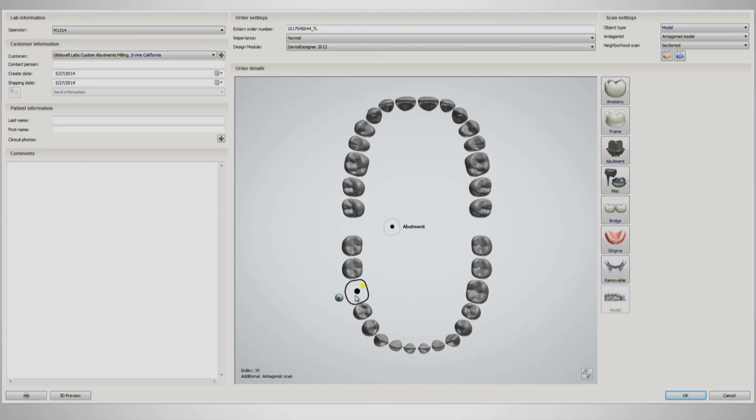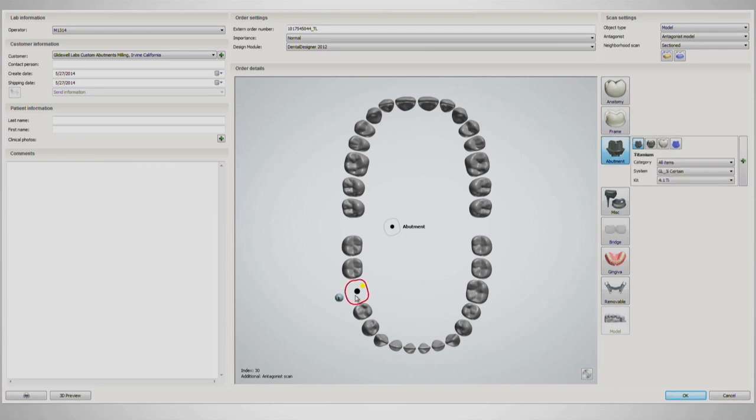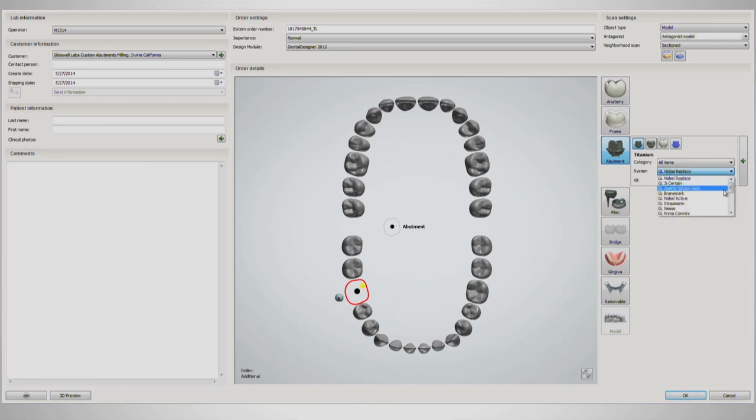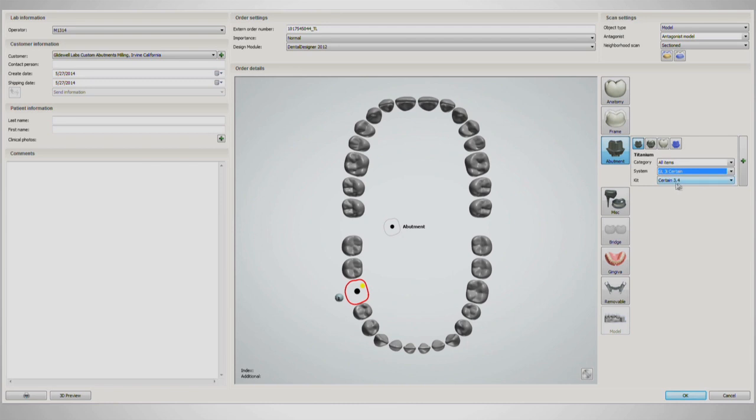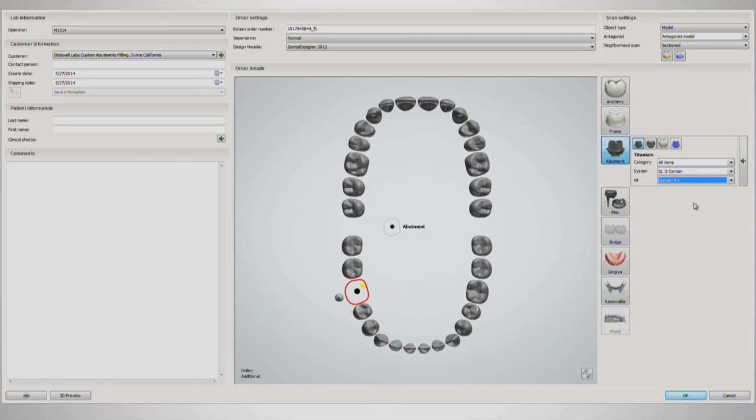The case is shown for a titanium abutment on tooth number 30. When the restoration is left-clicked, the abutment options can be seen on the right side. Material, implant system used, and diameter. Be sure to select the correct information based on the compatibility of the implant and the restoration. For this case, we'll be using the Titanium Biomet 3i 4.1mm.